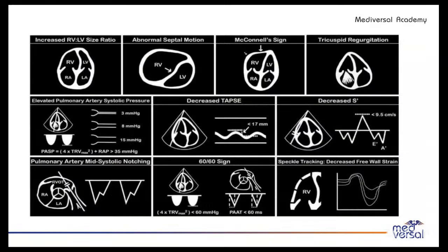And after that, for the right ventricle, we will look for any signs of pulmonary embolism. In acute pulmonary embolism, there will be increased RV size compared to LV size, and the interventricular septum is displaced towards the LV.